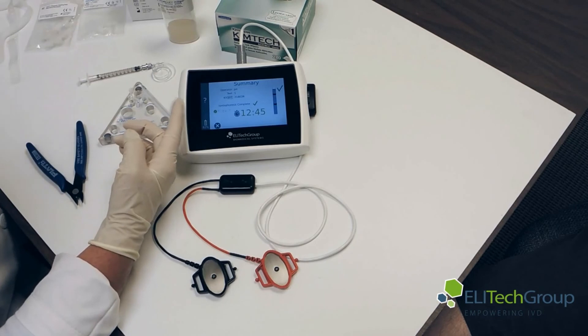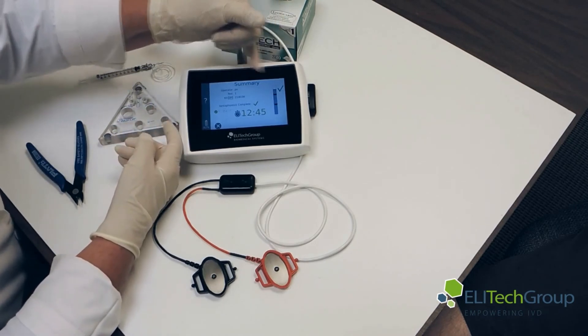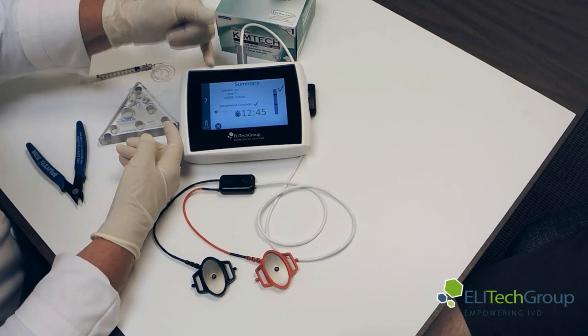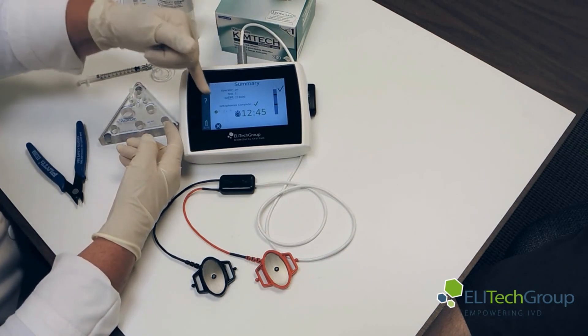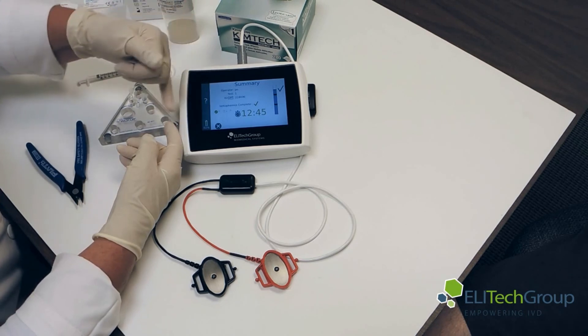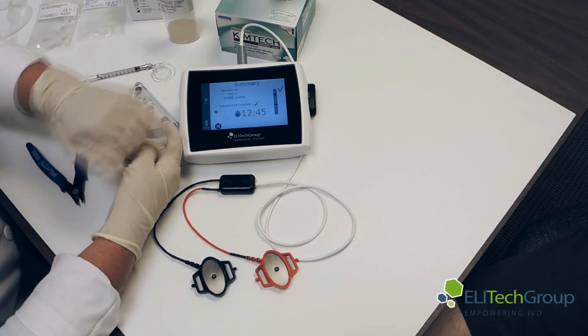You can see that we had enough sweat to do our test because we got past the two lines. The operator was Patty Nelson, test one, the kit number, and the iontophoresis was complete. It shows which arm we used and the test was a success.